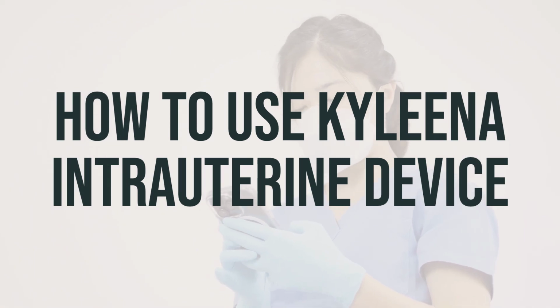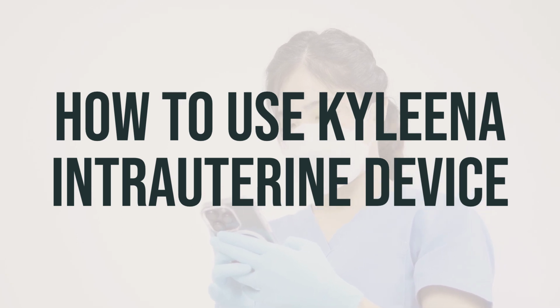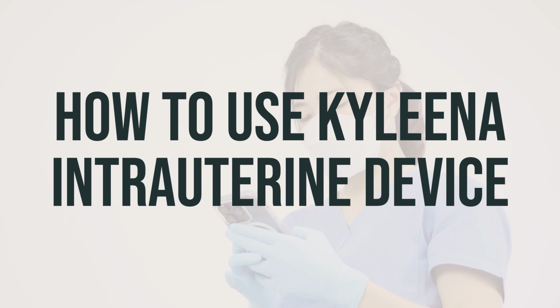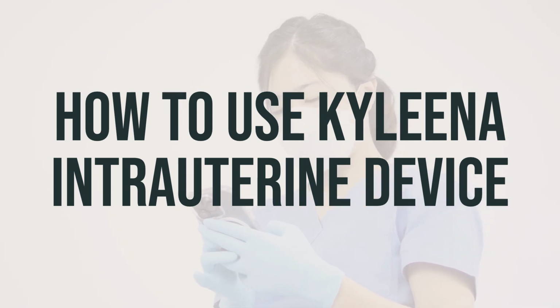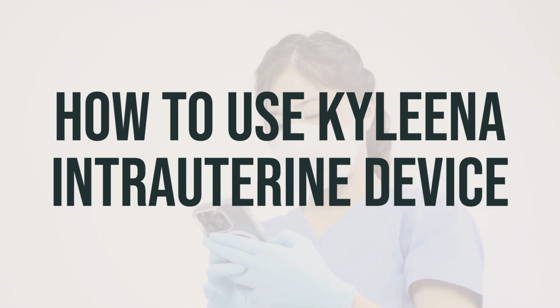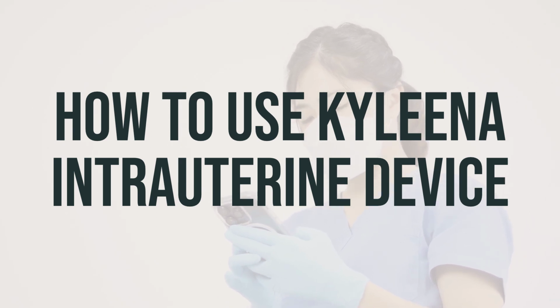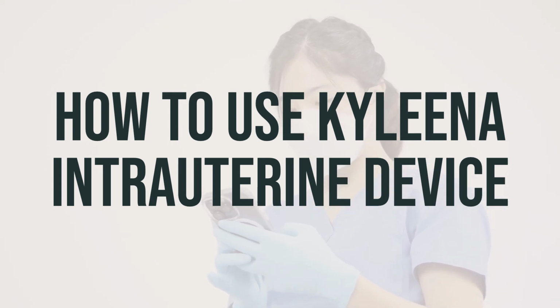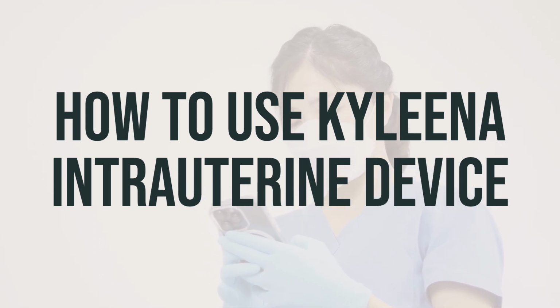Before using the Kyleena Intrauterine Device, be sure to read the patient information leaflet from your pharmacist. This device is placed in your uterus by a healthcare provider during an in-office visit and can stay in place for up to 5 years. It's important to schedule a follow-up visit 4 to 6 weeks after placement to ensure it is still in the proper position. Your doctor may advise using a backup form of birth control for the first 7 days after the device is placed to prevent pregnancy until it has enough time to work.